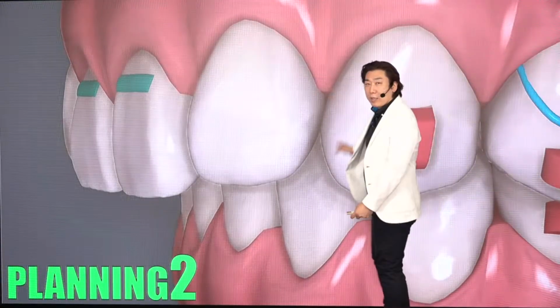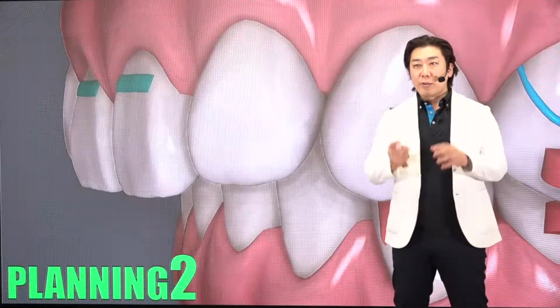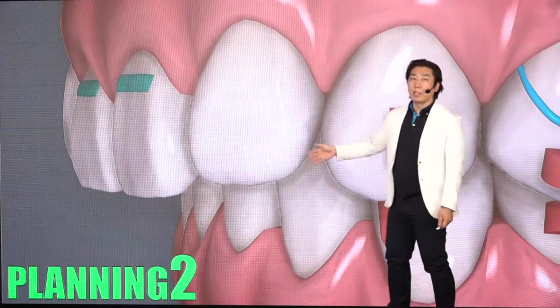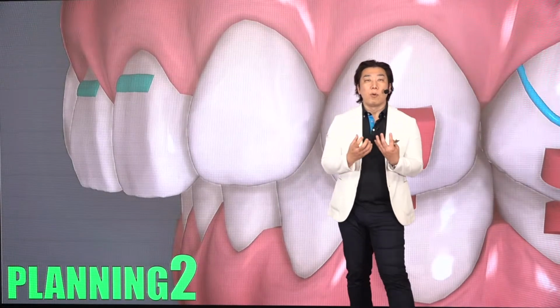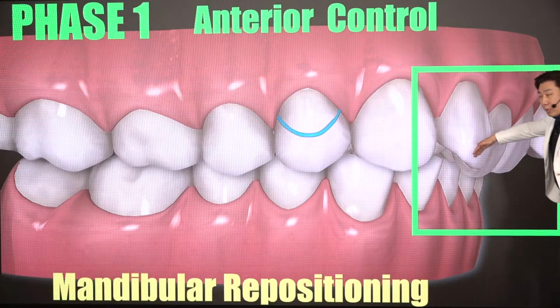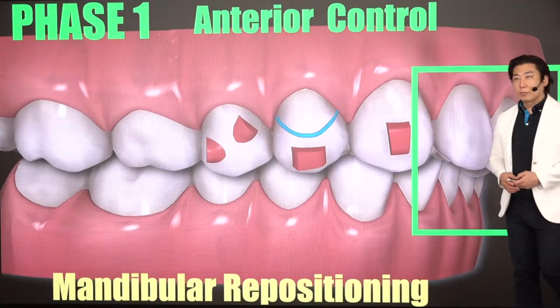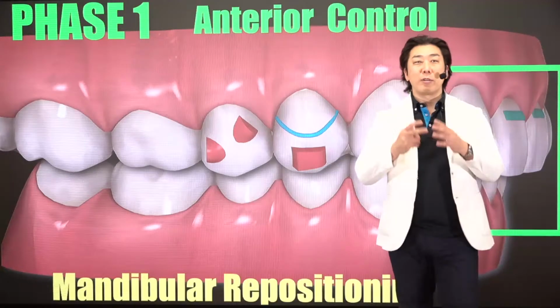But this simulation cannot transfer the mandibular forward movement. The orthodontist and the doctor have to imagine it. In your ClinCheck, how can you picture your patient in the real tooth movement, real molars? My approach is this. I decide on planning 2. When the patient's upper anterior teeth are proclined first, after that the patient's mandible naturally shifts forward. Here, initially, upper anterior teeth proclination first, then the mandible shifts to this position, like this. But this simulation cannot happen on your PC, on your ClinCheck, on your simulation.